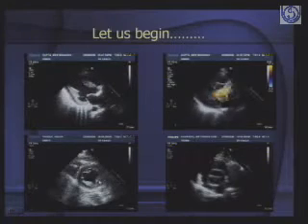Yes, Bangalore. Hello, Mangalore. Yeah, Bangalore, please. See, I want to know about the peak and mean gradient in aortic stenosis, because one of our professors thinks that peak gradient is important, not the mean gradient. You mean to say mean gradient is important to assess the aortic stenosis gradient, this one?